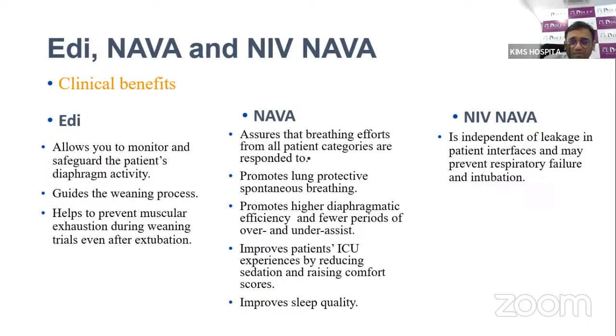By providing synchrony and proper respiratory support, the quality of sleep will be improved and the baby's weight will be increased. In the case of NIV NAVA, you can monitor the baby and have better synchrony based upon the baby's effort. We can adjust the Pmax, and based upon this, we can maintain the normal tidal volume. And as the interface does not need to be fitted snugly, because it is based upon diaphragmatic activity, which is independent of leakage, it prevents inadvertent respiratory failure and inadvertent intubations.